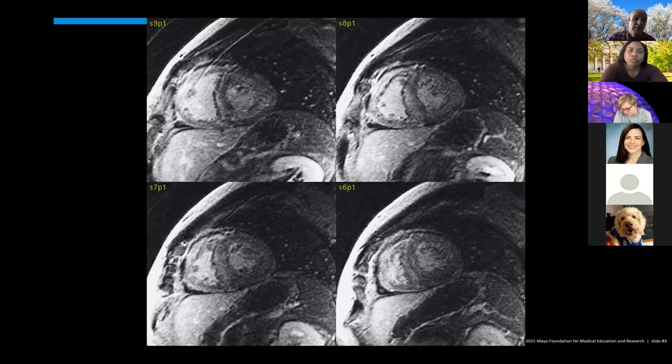So they might start asking you questions about T1 mapping. I don't think it's fair in all honesty, because it's not done everywhere.